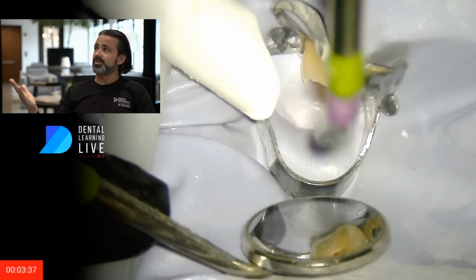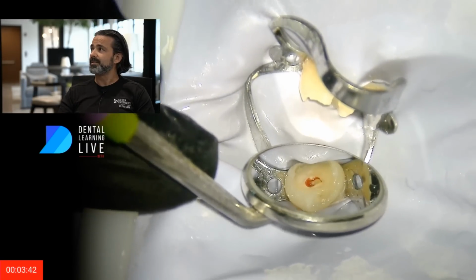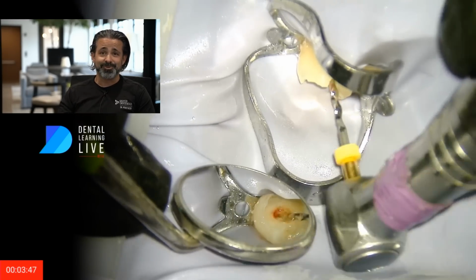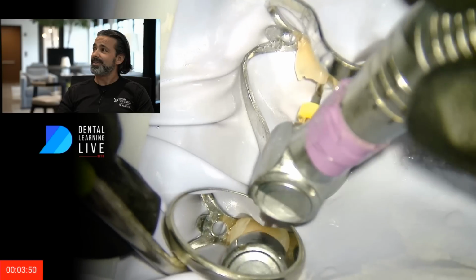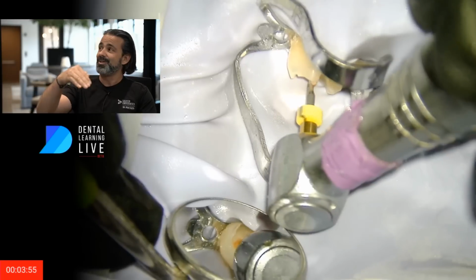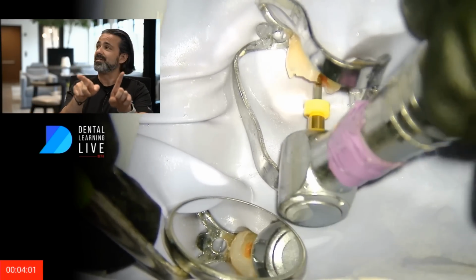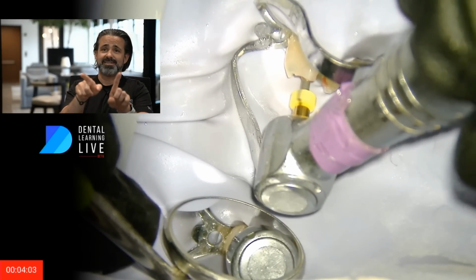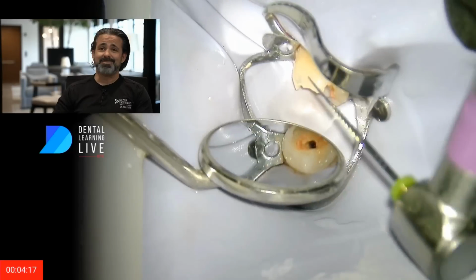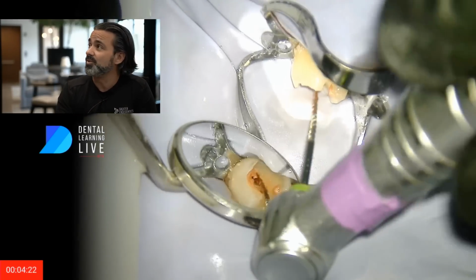You can see the exposure, the little pulpitis there. There is a stone in the way, so I'm going to pick at that a bit. I use a rotary explorer, which is also called an SX Universal. I'm going to pick that pulp out, pick that stone out, and instantly in my mind, I'm leaning that file, trying to go down the buccal and lingual wall, trying to see if I can feel that bifurcation. That's something I may find, I may not. I know it's halfway down that root, but I'm hoping I can get in it right off the bat. Then I'm switching to a 1506.